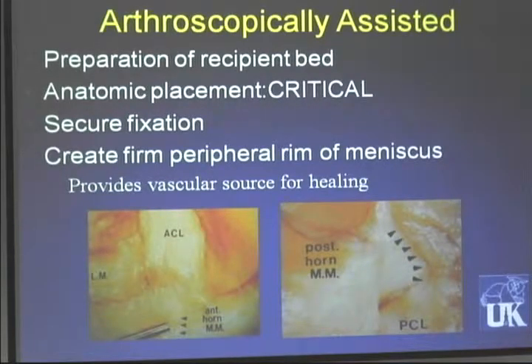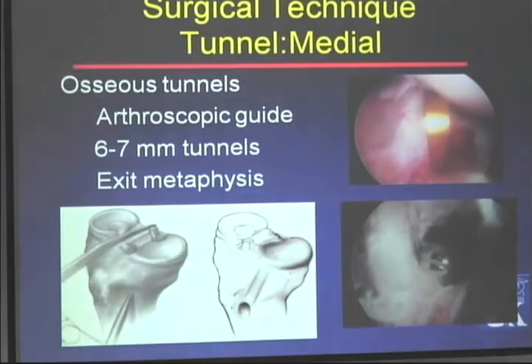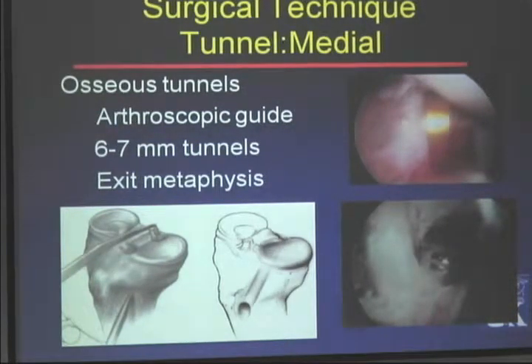Anatomic placement is critical. There have been some recent studies that have looked at this in meniscal allograft surgery, and they have shown if you miss the anatomic root site at all, you're going to have problems with your meniscus. It makes logical sense, but we as sports medicine surgeons somehow get away with non-anatomic surgery a little bit, whereas when we talk to our fracture surgeons who do pelvis surgery, if they miss the pelvis reduction by 2 millimeters, it's the difference between having a total hip and you doing well. If we were that critical on ourselves doing ACL surgery, 2 millimeters, wow, that'd be concerning. So you need to be anatomic and you need to be exactly where you want to be.